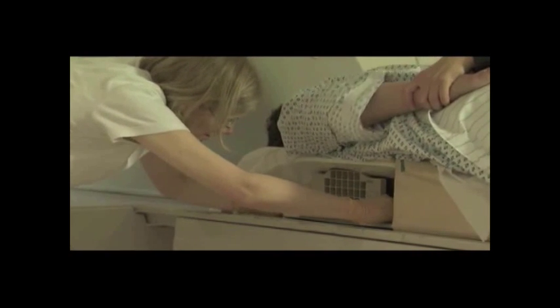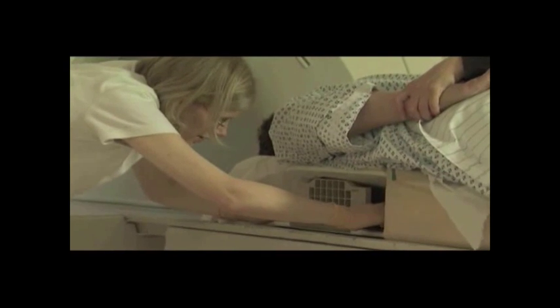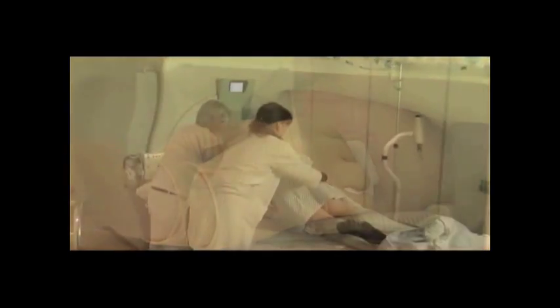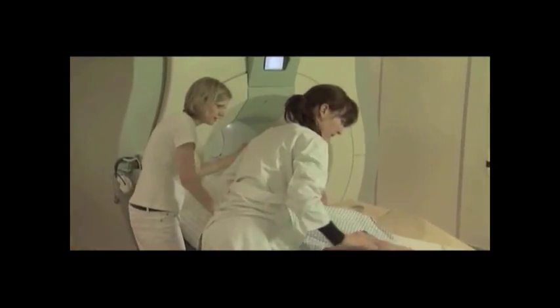Slowly decompress the breast and remove the compression grid. Immediately apply pressure to the biopsy site and when ready, assist the patient out of the coil.